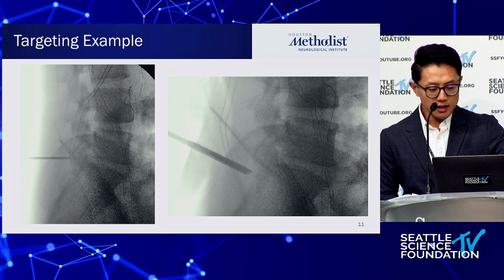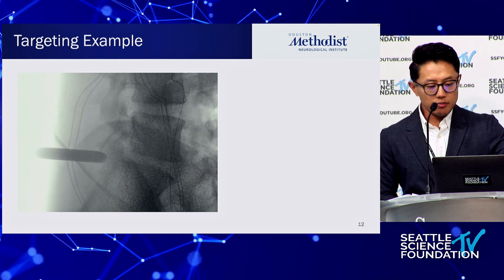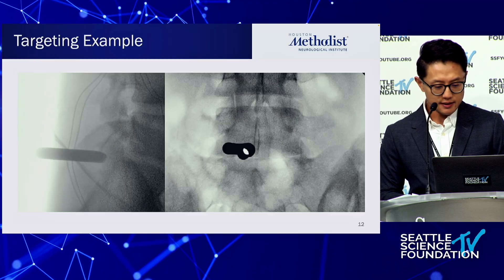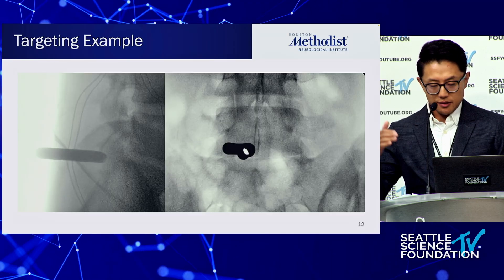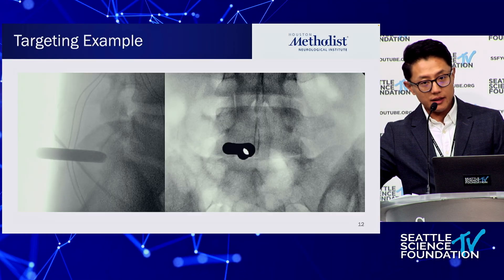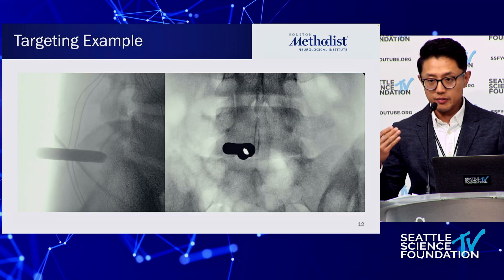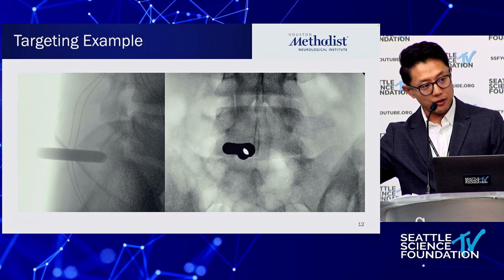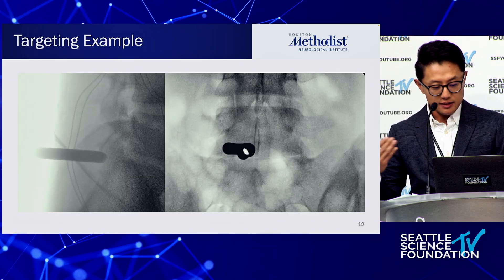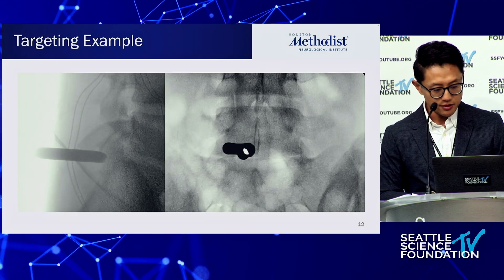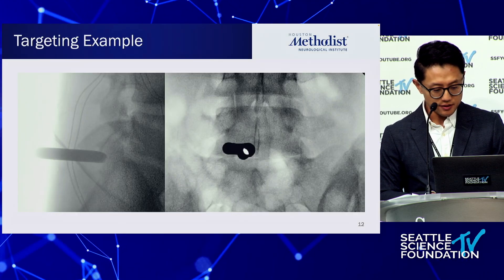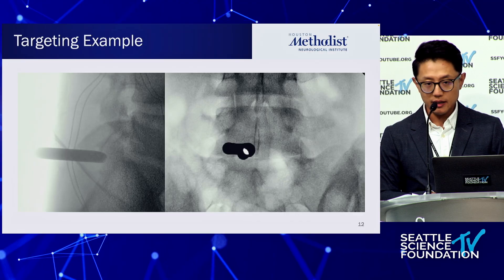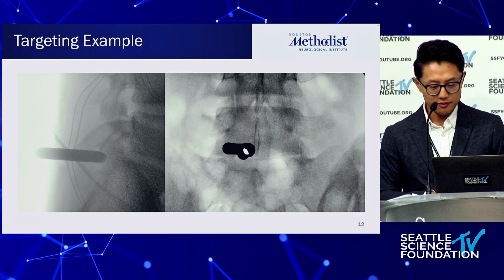Once you do that, you can dock your probe — and this is what it should look like. Generally, if you start a little more medial, these scopes all have about 15 degrees of angulation, so you can look lateral and undercut the facet, decreasing bone resection and minimizing disruption to the facet joint. In many cases at L5-S1 you don't have to remove any of the facet joint at all.